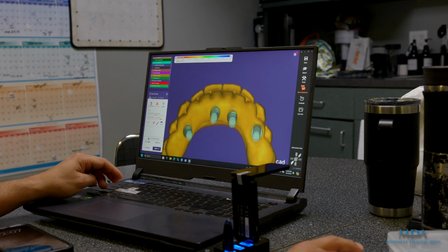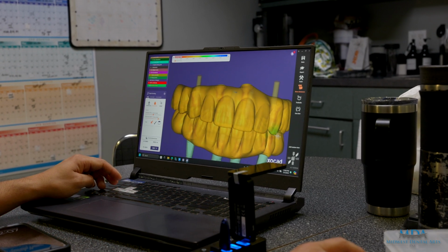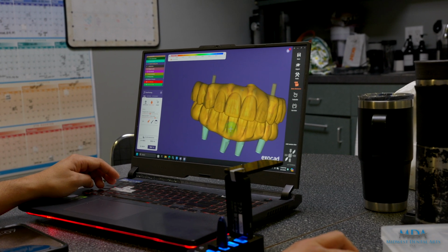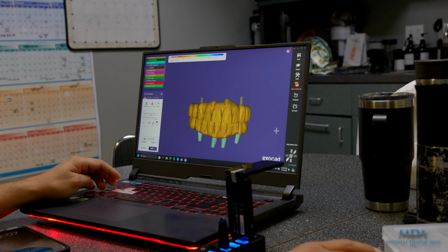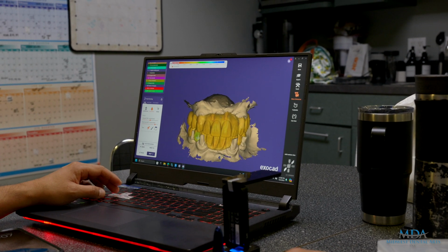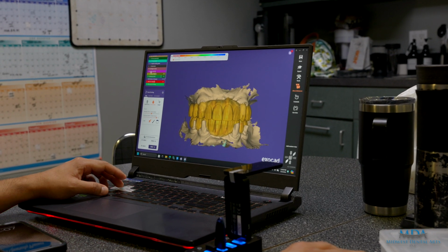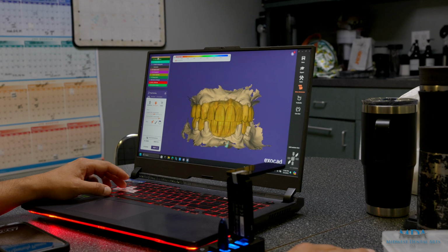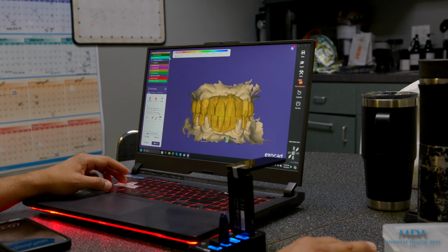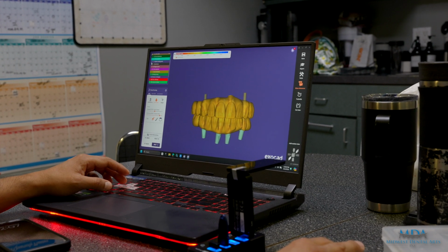All right, now we check the final details. Like I said, we don't want to modify much of the buccal areas since that's where most of the detail work is. The bite is on perfect. The jaw, that's where we picked them up. These teeth have been extracted right now. And basically, if we could just overlay these two, let me see if I can get you a better view. That's how it's right now. That's where we're going. That's where the implants are.